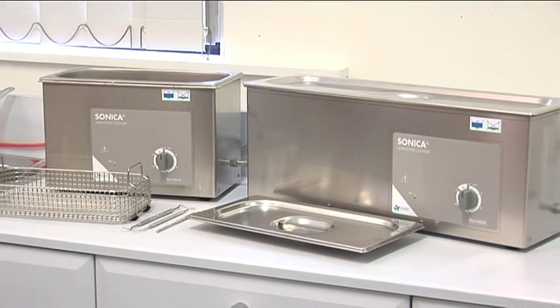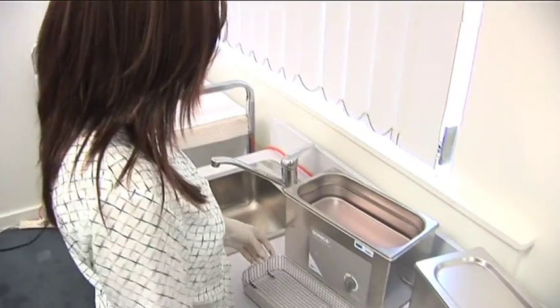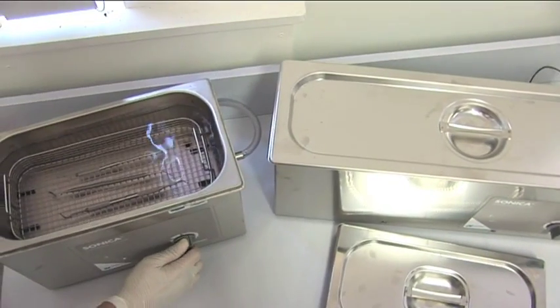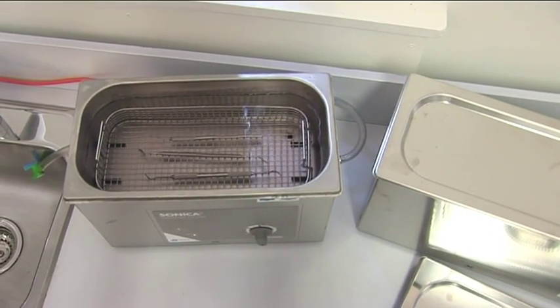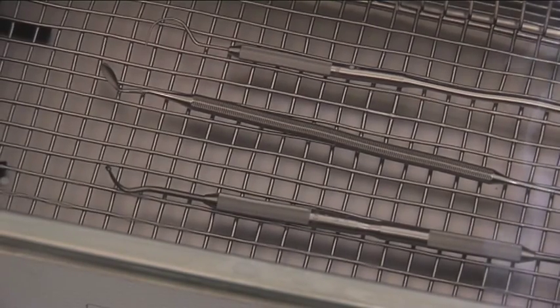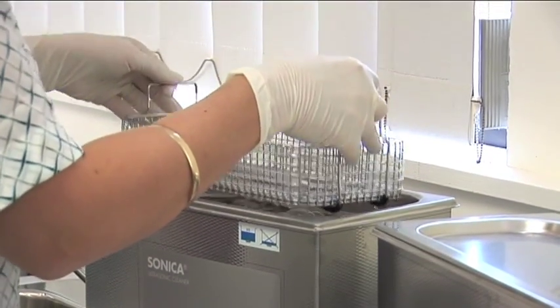The high quality Soltech brand Sonica ultrasonic cleaners are handmade in Italy and offer the best performance to price ratio available. Ultrasonic cleaning has long been recognised as the most effective method of cleaning and maintaining your instruments. In Soltech Sonica ultrasonic cleaners, cavitation of liquid causes microscopic implosions to occur over all surfaces of immersed instruments. This gentle action provides exceptional results, especially in hard to reach locations, and will consistently produce clean, shining instruments.